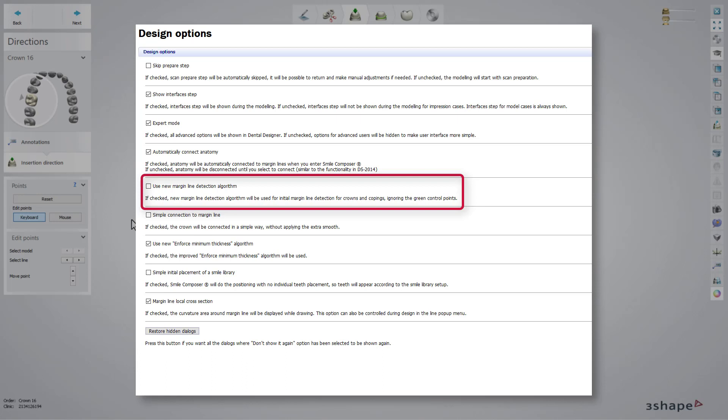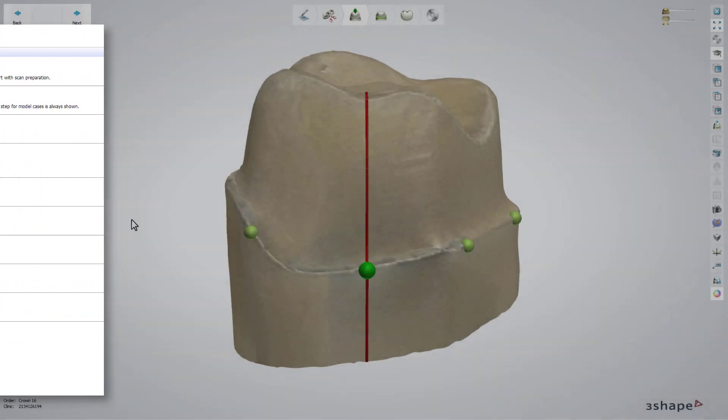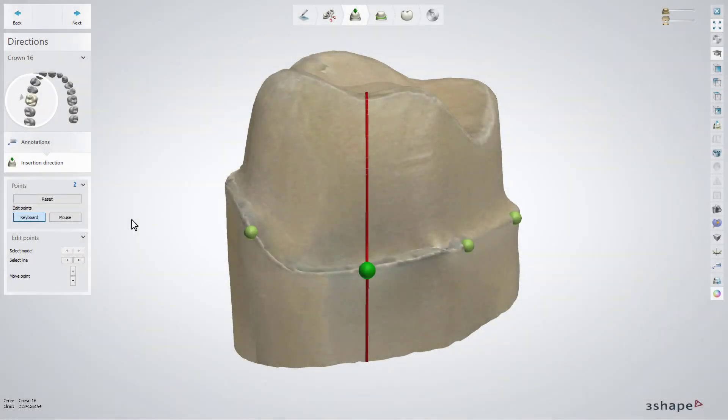If it's checked, the new algorithm will be used for initial margin line detection for crowns and coping, detected by the annotation point, ignoring the green control points. If it's unchecked, the green points are used for margin line detection.